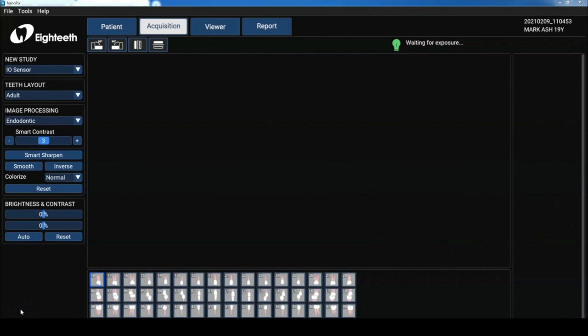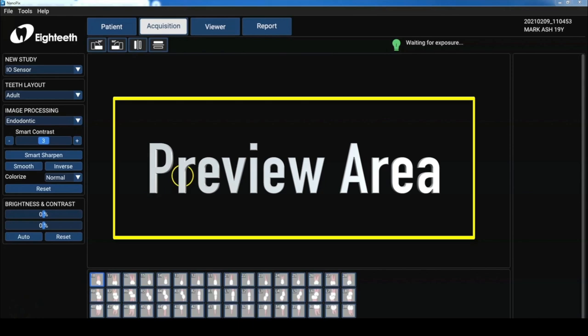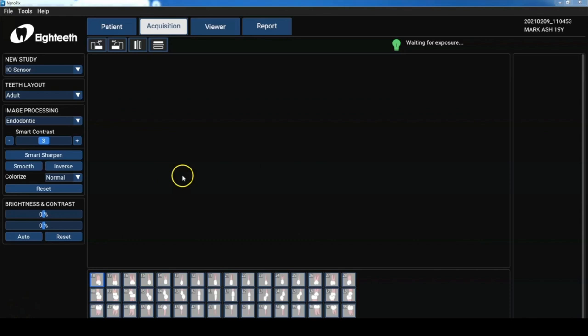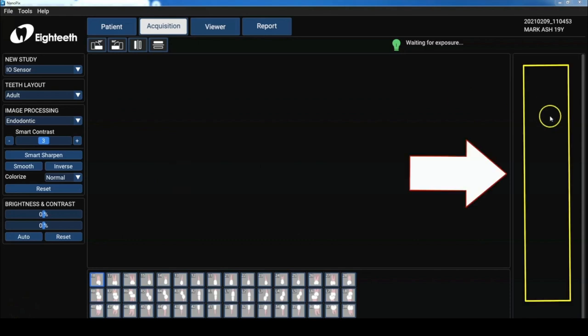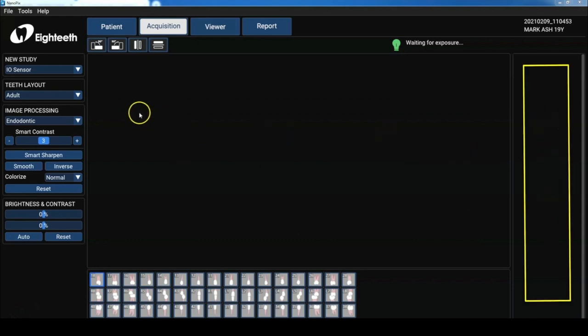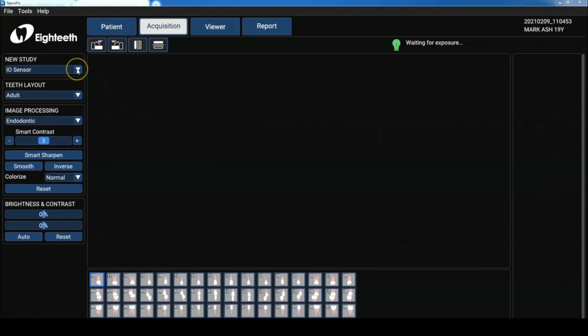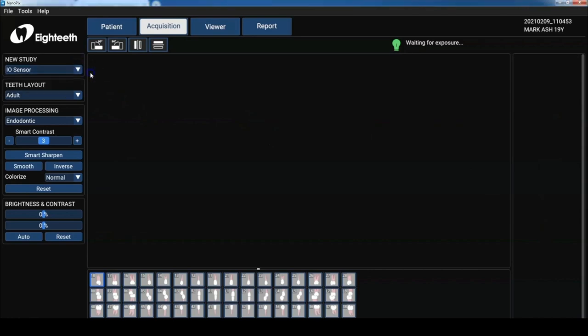Let's get into the acquisition screen. So right up front, there's a large image preview where we see our image as it's captured. And then the panel to the right is used to display thumbnails of recent images. Now we can either use our intraoral sensor or import previous radiographs.